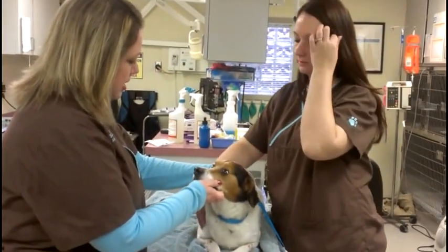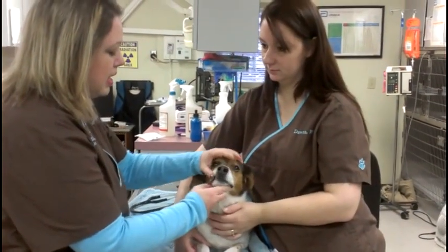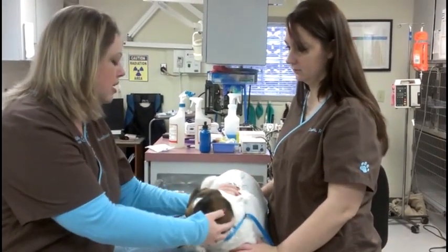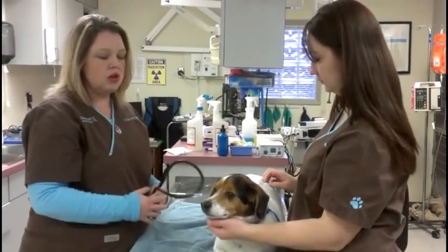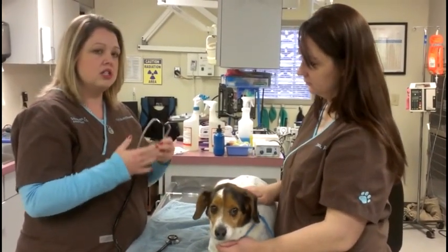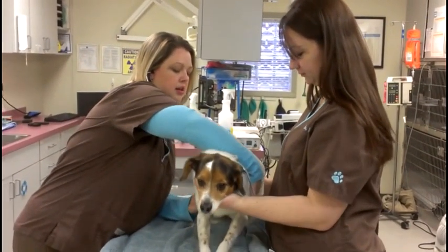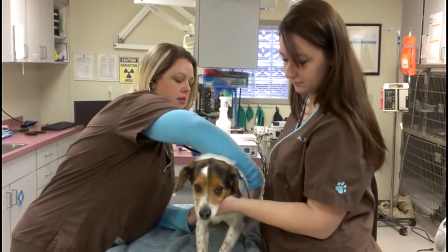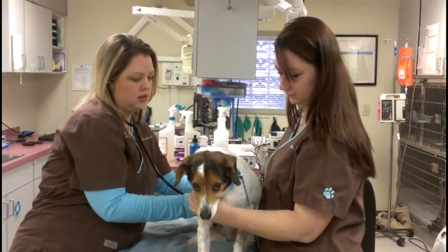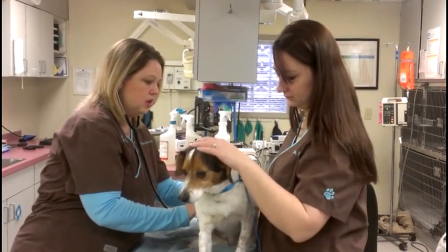So for her, we're going to go ahead and start, just take a quick look at her, make sure everything looks nice and healthy. Check her color on her gums, make sure she's nice and pink, make sure there's no swellings in her lymph nodes or anything like that. Let's take a listen to her heart and her lungs, make sure everything sounds normal in there to make sure that she's going to tolerate the anesthesia okay. So we'll go ahead and do that. And on her, everything sounds really good.